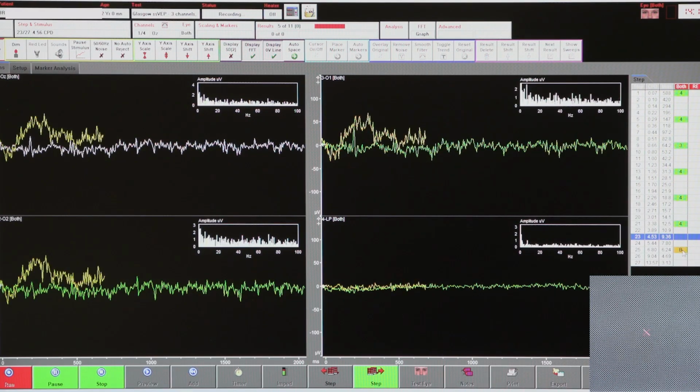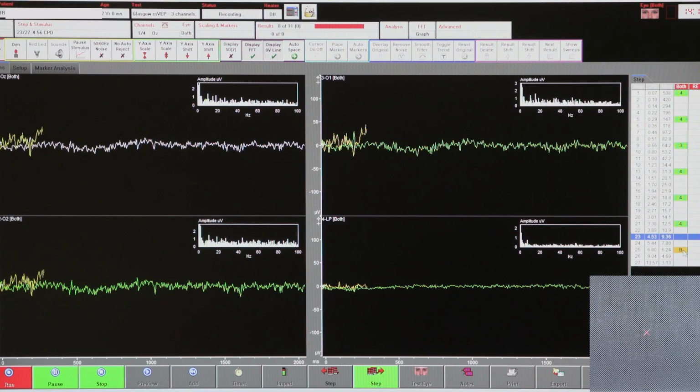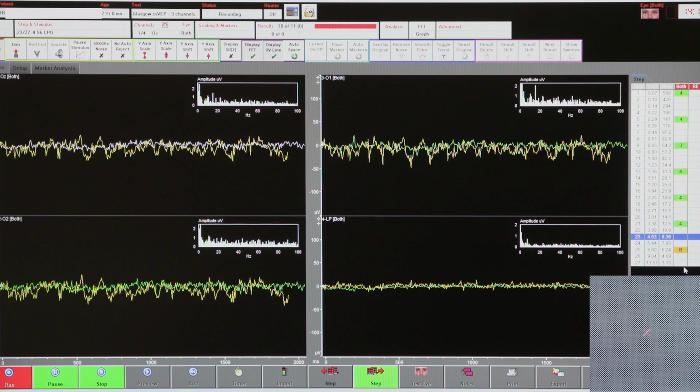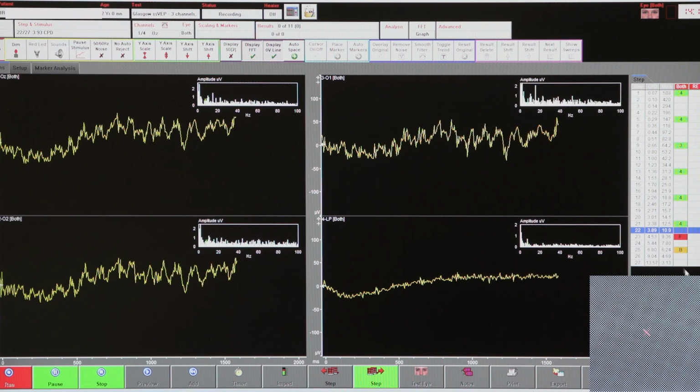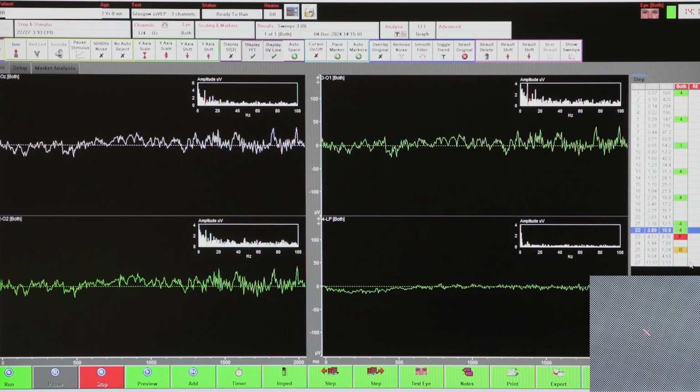There we have an amber result. Same as a red as far as the algorithm is concerned, i.e. no VEP is present, but with a close to statistically significant result, as we already talked about. We will therefore jump up 2 steps. No VEP detected there, hence red. So the test is complete now. Looking at the table on the right-hand panel, you can see that in a downward direction we have green, green, red results for consecutive check sizes, and that is how a threshold is defined. This is analogous to a similar threshold finding technique used in auditory electrophysiology.